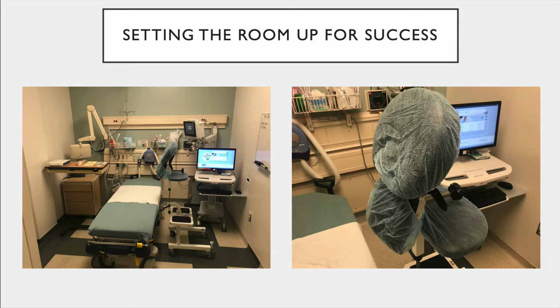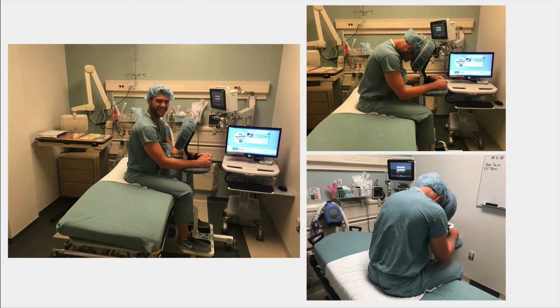So fix this in your head about what this should look like in the morning time. I wanted to point out that the massage chair itself needs 3 little caps on it for one part here, and one part there. But ideally, this is what your room should look like. Okay, let's talk about patient placement.